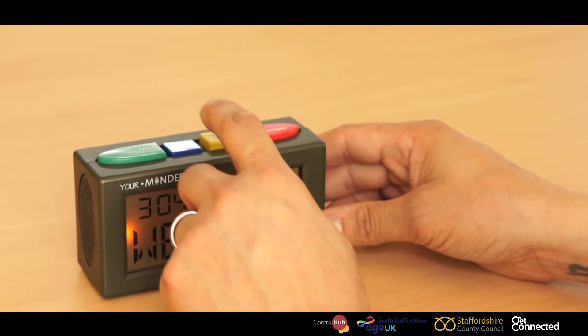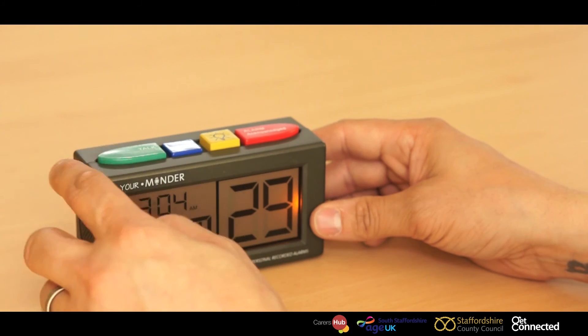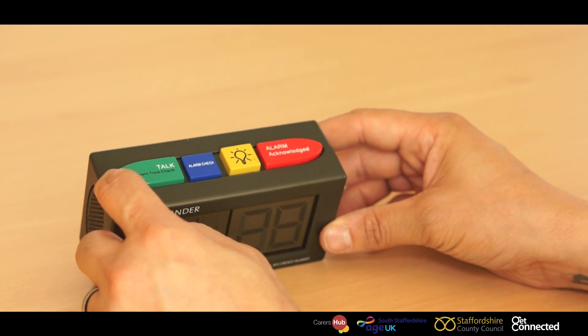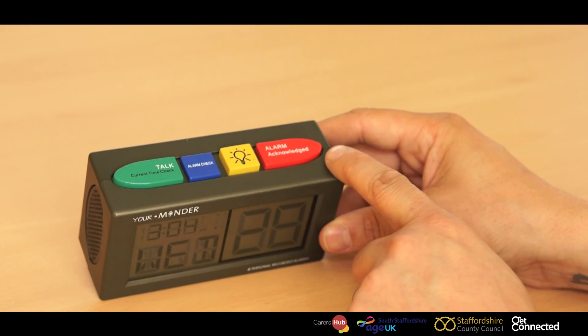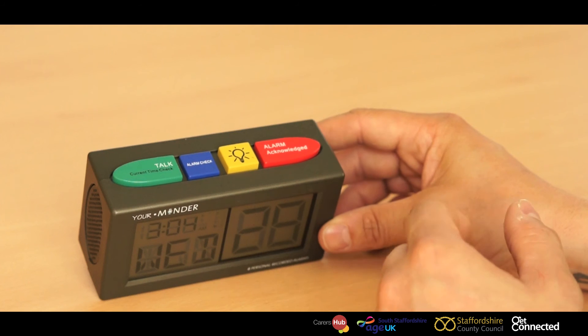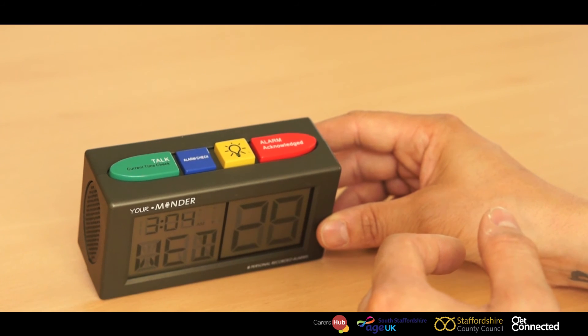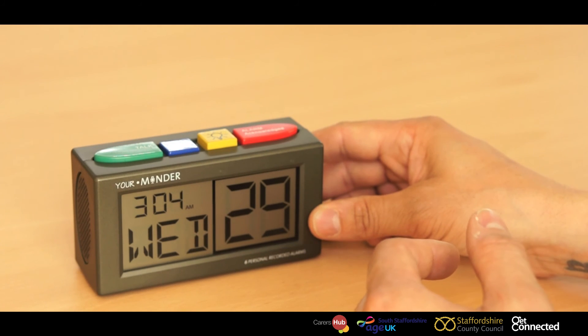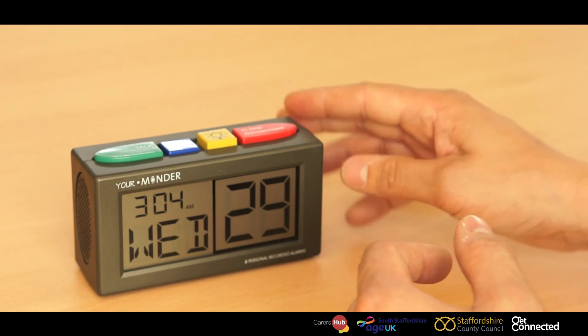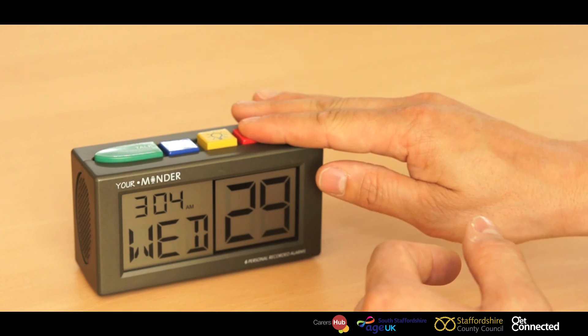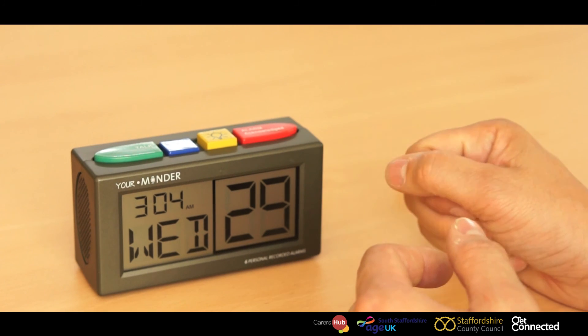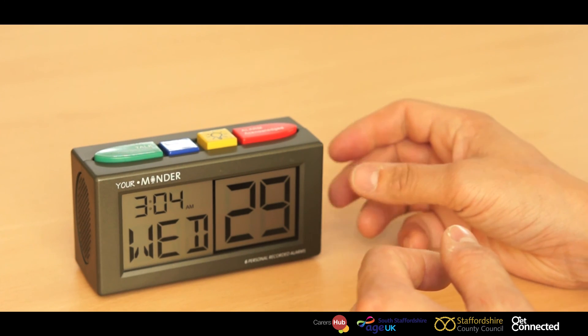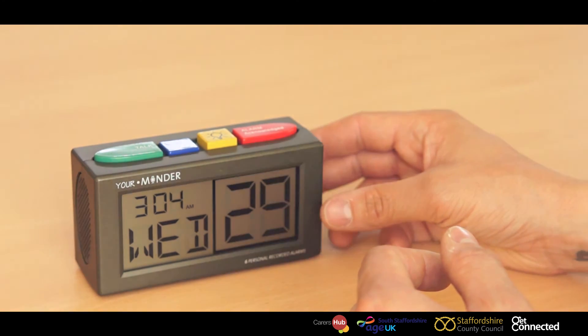And also an acknowledgement button. The acknowledgement button is for when the prompt is being played and mum's acknowledged the prompt, she can just push the button and it will stop the prompt from playing any further.